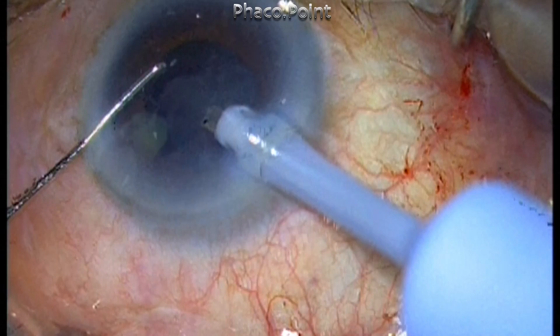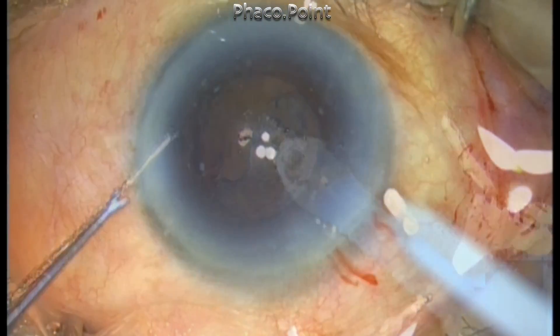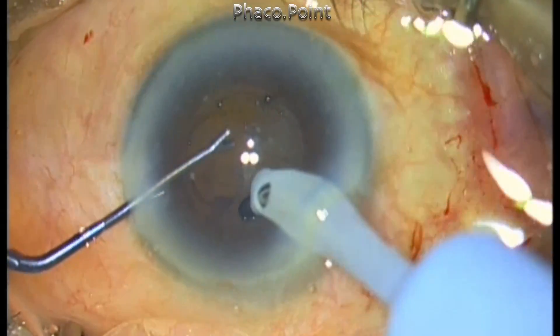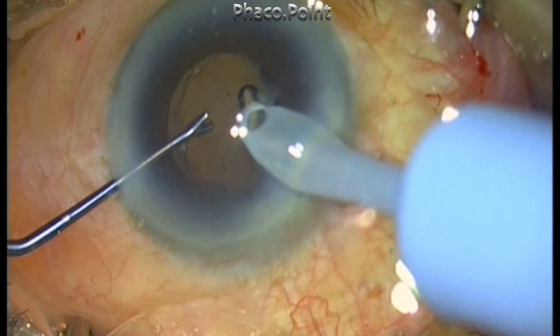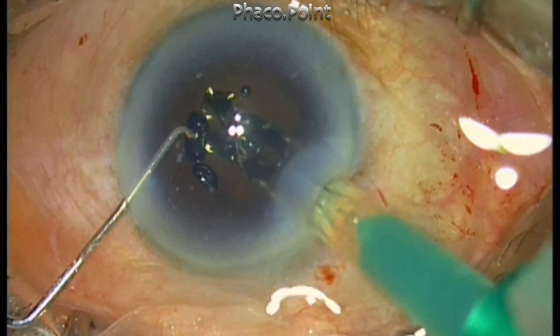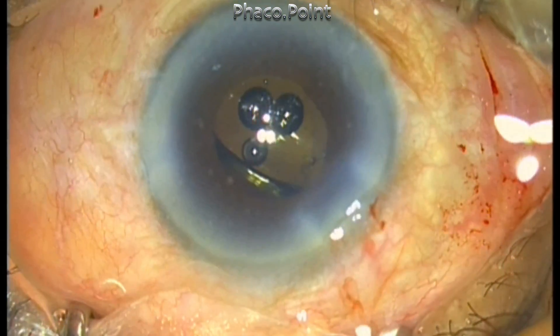The epinucleus sheet is then aspirated while staying above the pupillary margin. At the end of the procedure, the pupil has not really changed its size. The whole procedure was completed without any complication and quite easily — thanks to the epinephrine in the BSS bottle. Thank you for your attention.